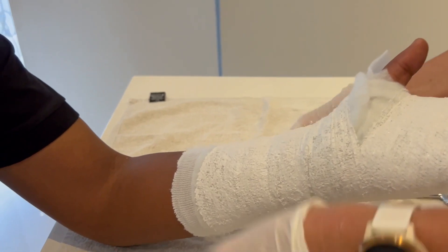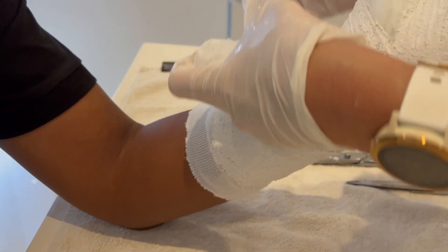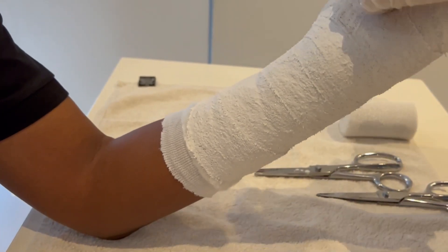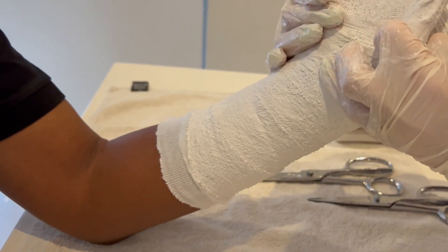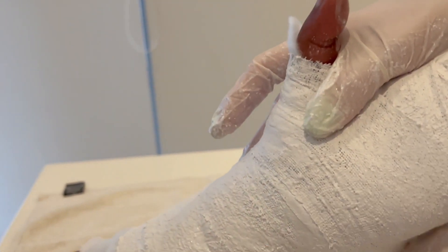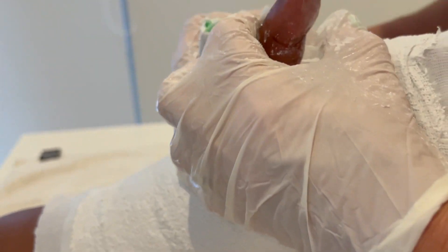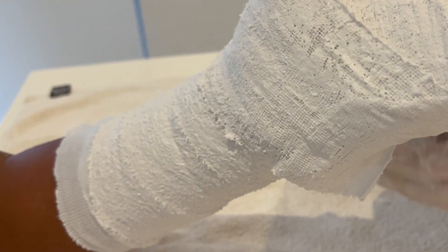I work fairly quickly — keep your elbows stabilized on the table, Mr. Zulu. Thank you. Don't lift it — if it's floating in the air it's very unstable for me to work with. It will become warm. We're going to bring your thumb around. I start to position it where I want it to go. You can always tell when you've got really nice material because it's almost milky and it's soft — and now you rub.